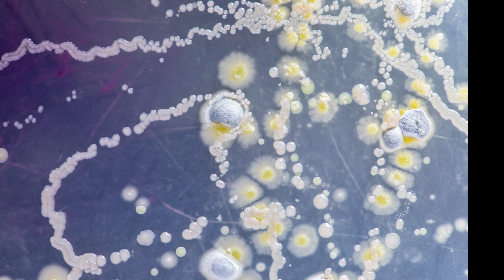get any differences between the two test dates, if you are going to look at the plates the day after again. So storing them at room temperature, there is a big risk that things will start to happen, that zones will get smaller because your organism is growing, that you will get colonies within zones that weren't there the day before. But if you store them in the fridge, you usually have more or less the same results the day after.